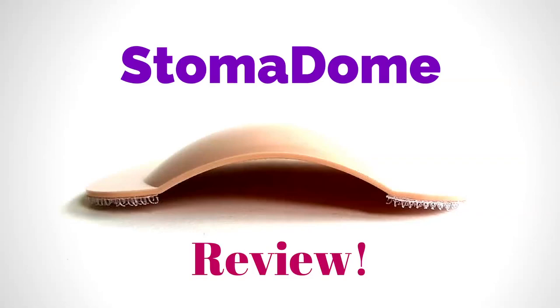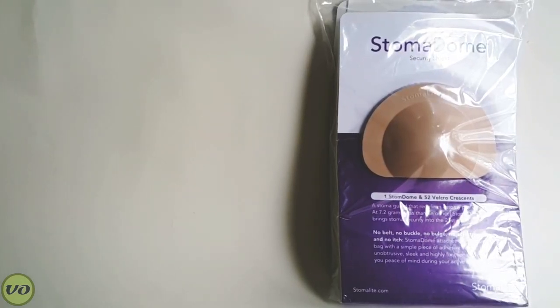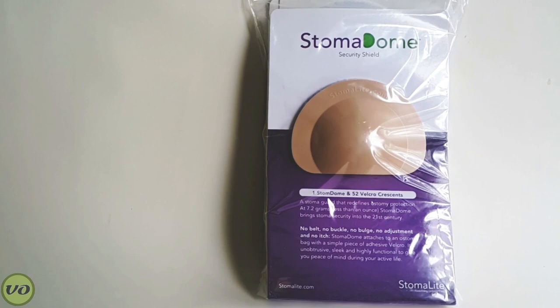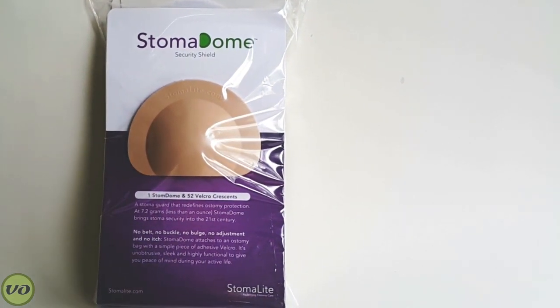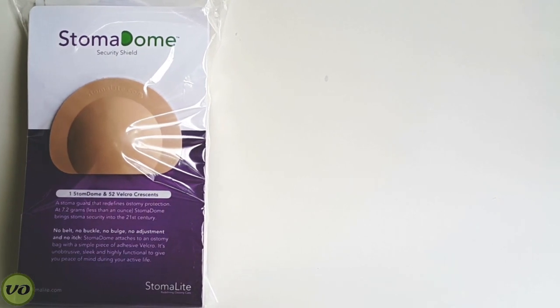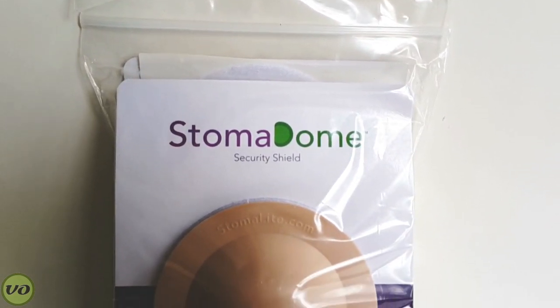Hey guys, I want to bring you a new product review. This time it's on a stoma guard called the Stoma Dome. One of the really unique things about the Stoma Dome is the fact that it doesn't require any kind of attachments to keep it on you — there's no belt loops, no band or anything like that — which really sets it apart from a lot of the other guards I've seen and used myself.